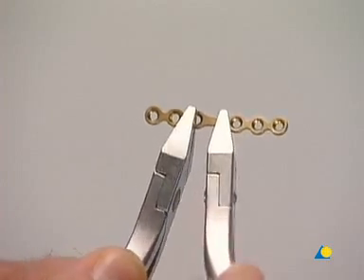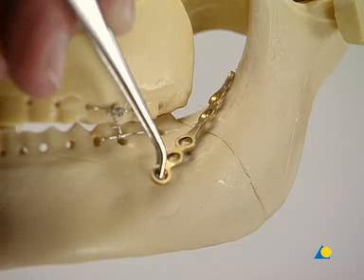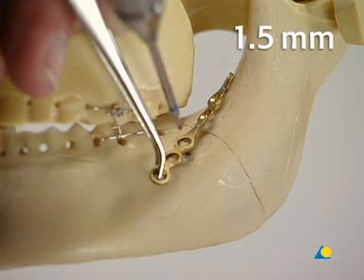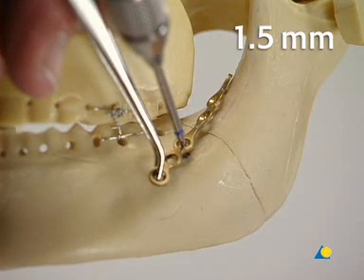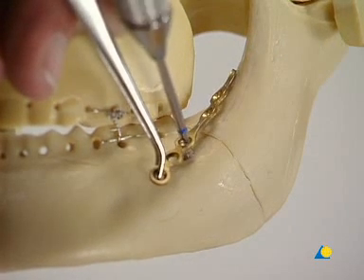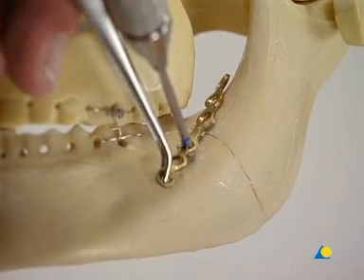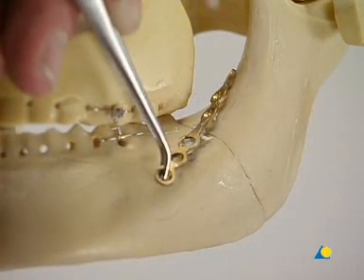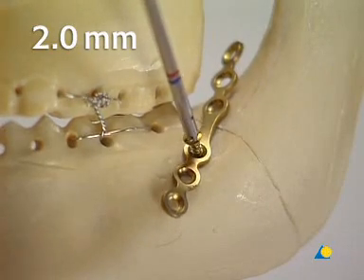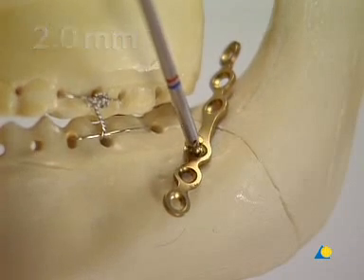The plate is contoured with bending pliers to match the anatomy. The first hole is drilled monocortically, close to the fracture, using the 1.5 mm drill bit with a 6 mm stop. The drill should be held at approximately 90 degrees to the plate and bone surface. A 6 mm long, 2 mm screw is inserted but not fully tightened to allow for any plate adjustment.